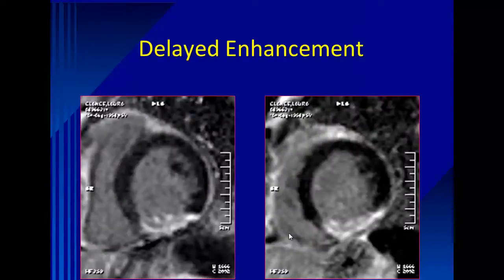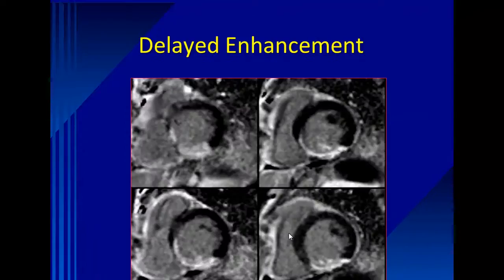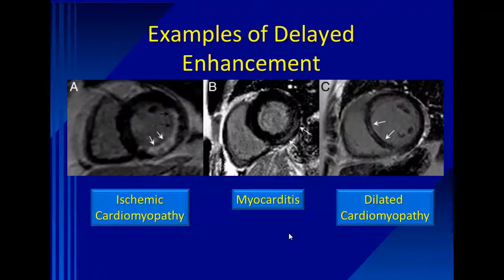So here's another picture of delayed enhancement of the inferior wall. This is a transmural infarction, which if we revascularize that, likelihood of any substantial improvement in LV function would be minimal. In fact, surgeons won't bypass those. Okay. A lot of delayed enhancement. These are real pictures instead of those images that you saw earlier of what an ischemic cardiomyopathy looks like. Here it is subendocardial and an infralateral infarct.